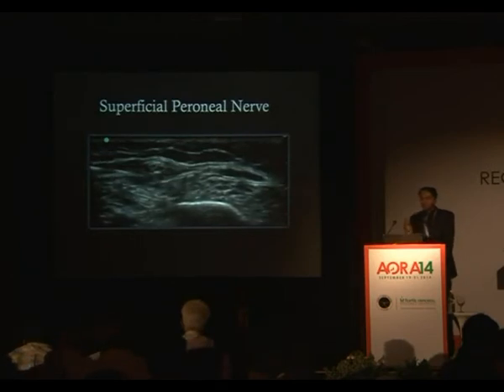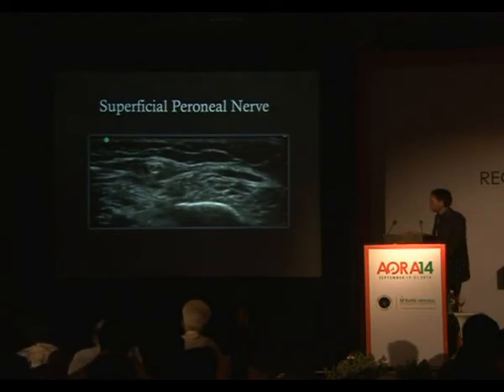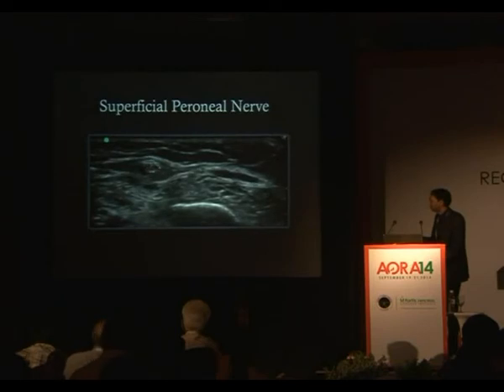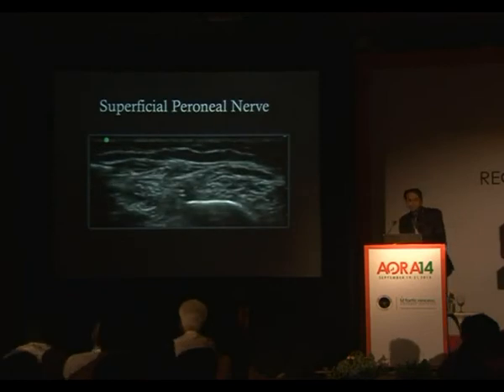Most of the time, you need to smoke these nerves out. They're all hiding, and once you put a bit of fluid around there, you can see it a lot better. So this is the nerve here. If you measure, these are about 2, 3 millimeters.